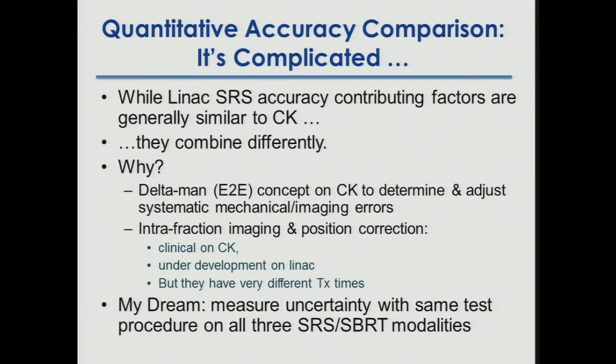You can also do stereotactic radiosurgery in whatever other machine you have. Because right now, if someone tells you, oh, my machine has X amount of uncertainty for stereotactic radiosurgery, we're not just comparing apples to oranges, we're comparing apples to potatoes. So you need to be very careful and ask, what do you define as your uncertainty?